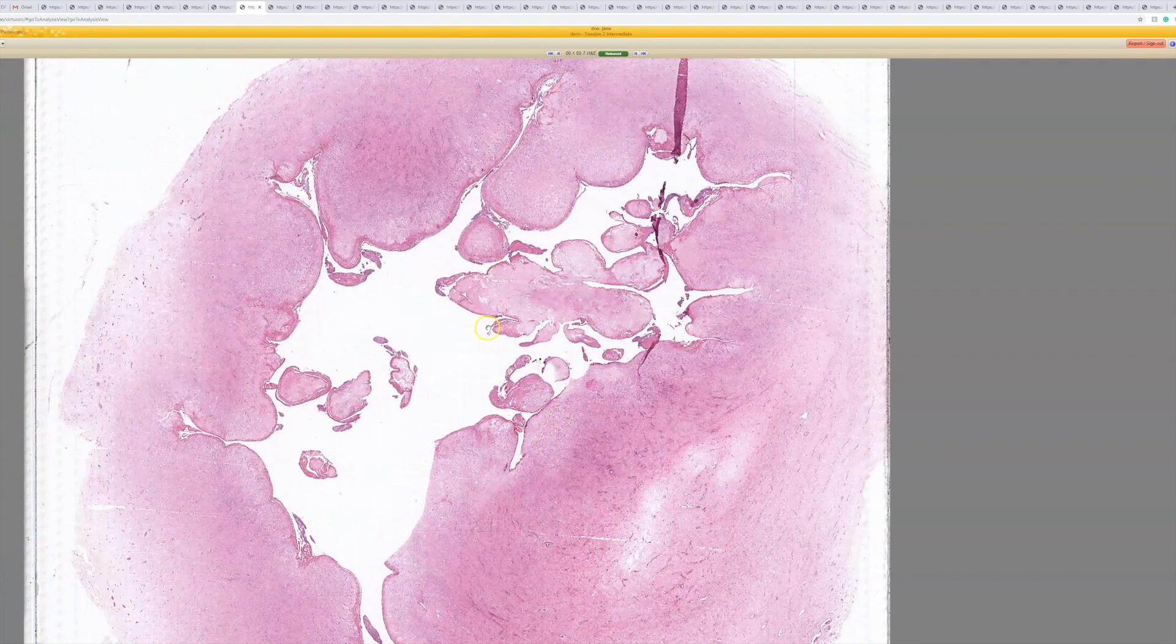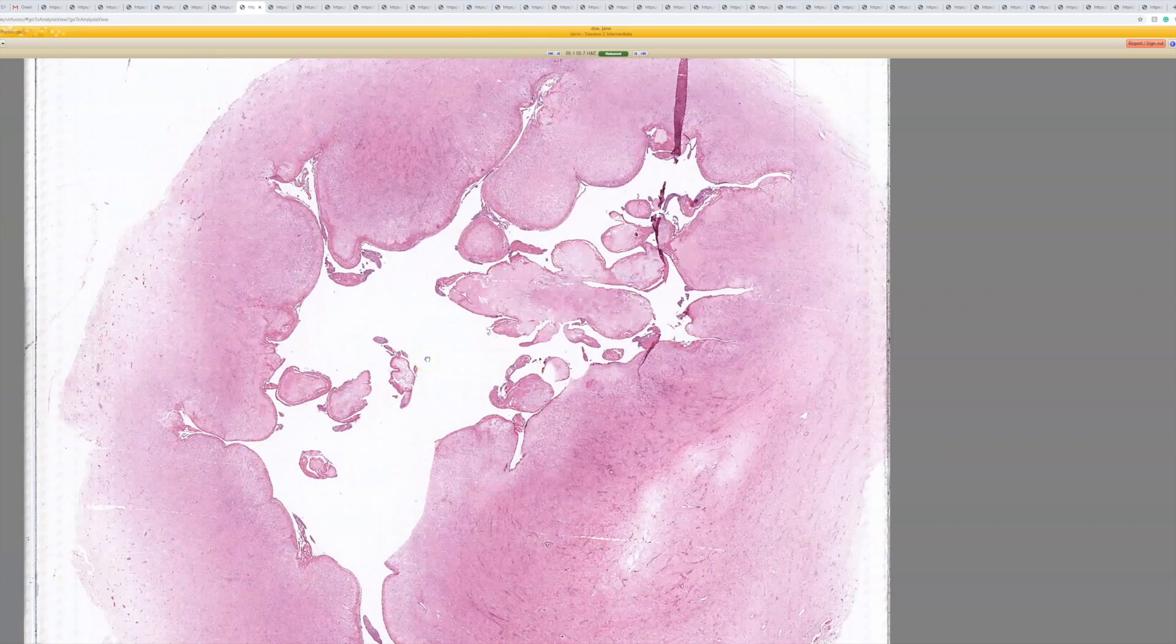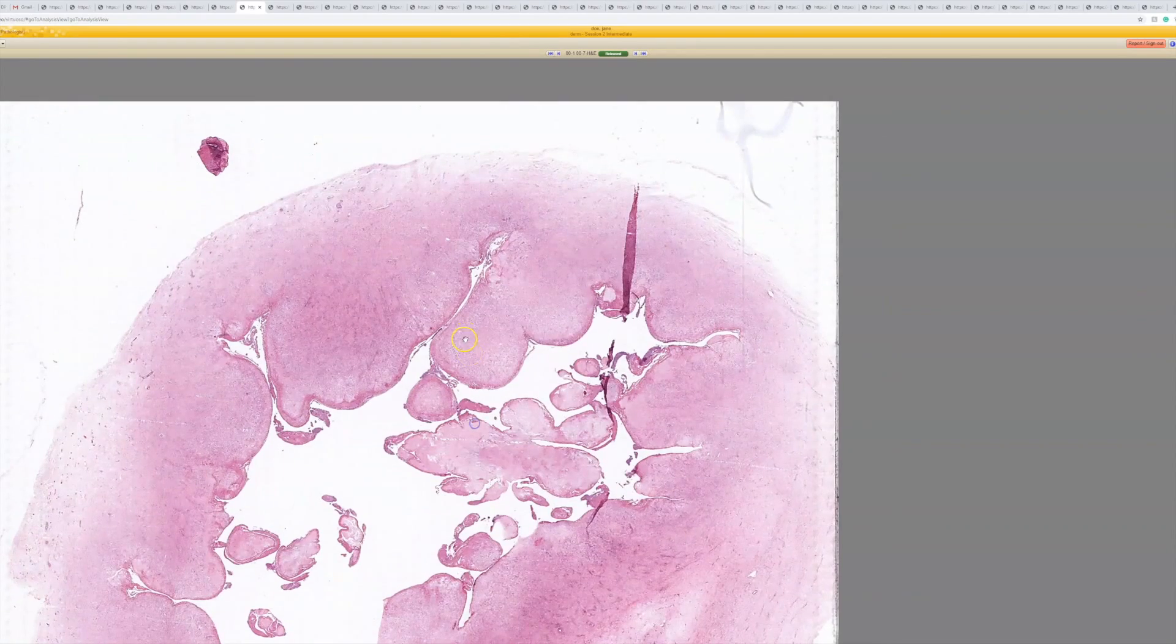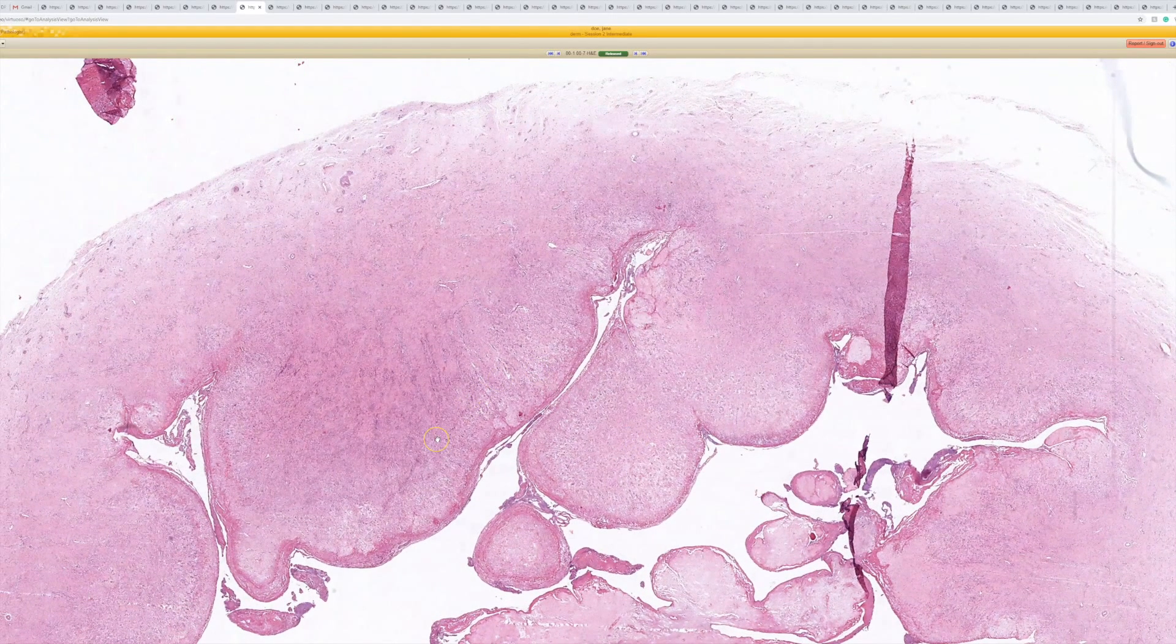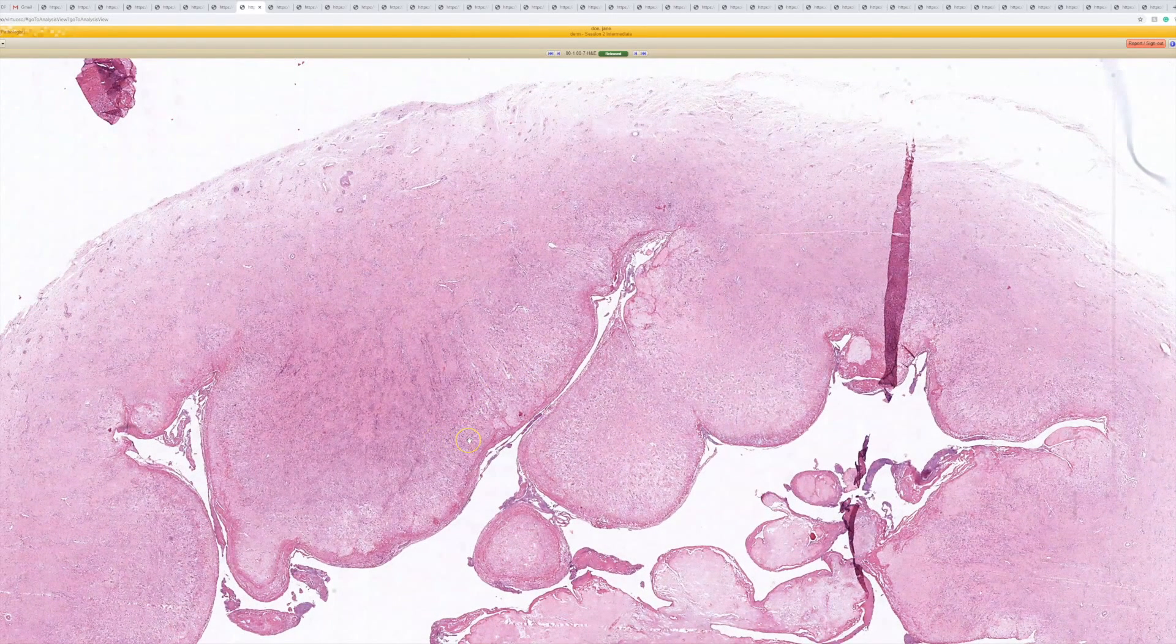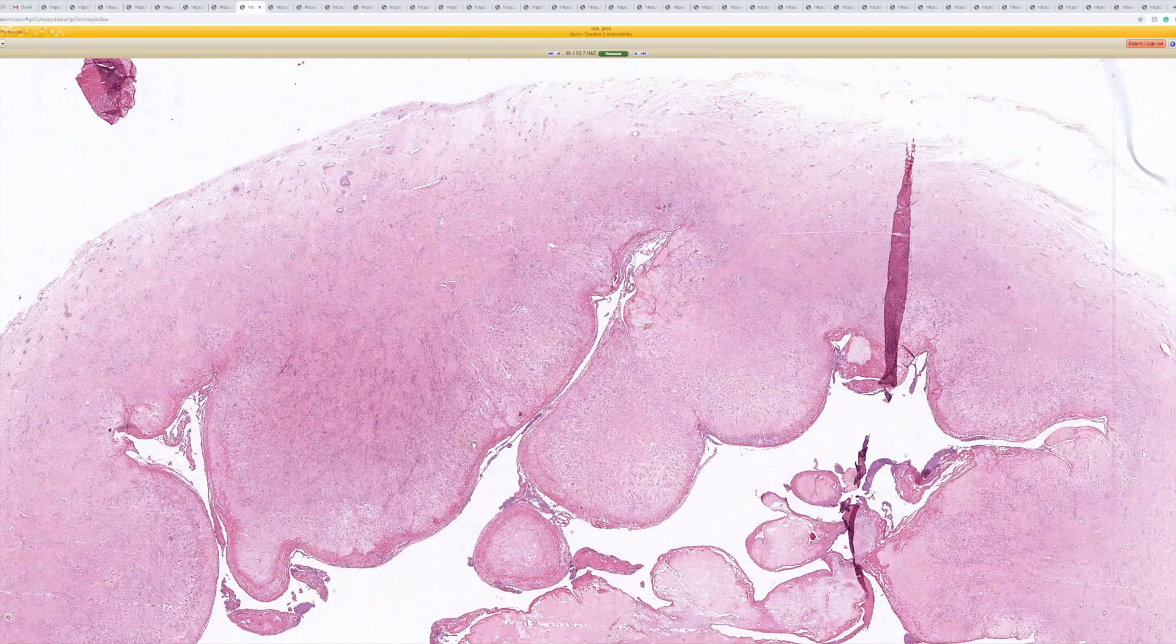I thought what fit best was a metaplastic synovial cyst that would probably work too actually. This is, I know these are all Dr. Ferringer's slide set, so these are all new to me. I just basically looked at them today.